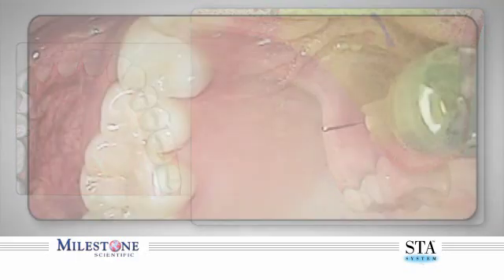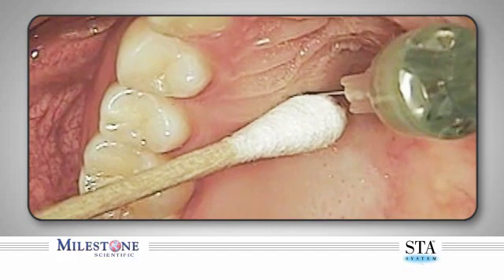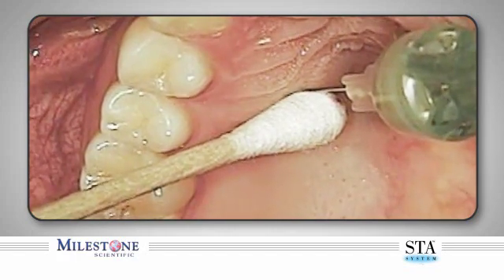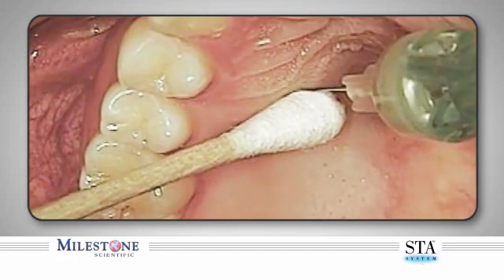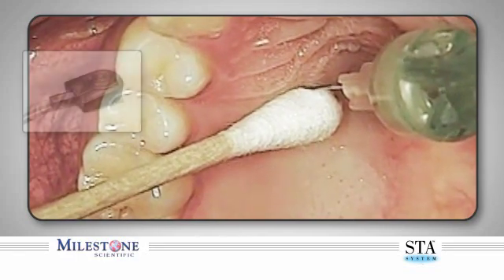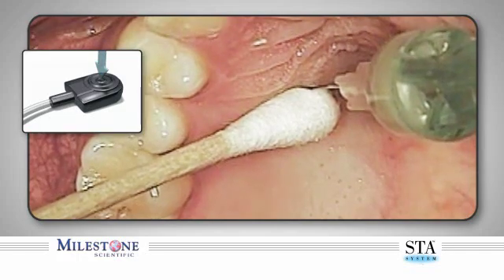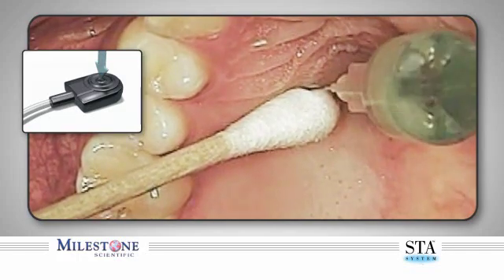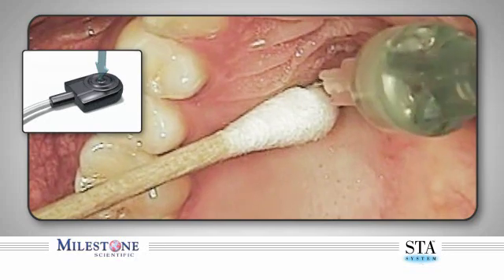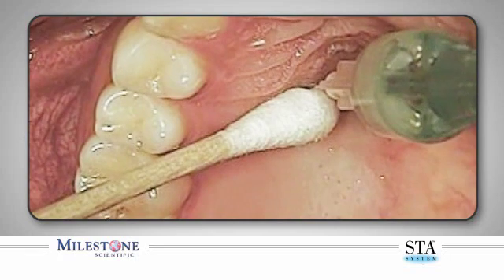We will now show a clinical example of the AMSA injection being performed. Observe that the needle tip is applied to the surface of the palate, followed by placement of the cotton applicator to the needle tip with firm pressure applied. Once the needle is stabilized, the flow of anesthetic is begun by initiating cruise control. Observe the bi-rotational insertional technique allowing the needle to penetrate the surface by one to two millimeters, followed by a pause in forward movement for an additional four to five beeps before advancing again.